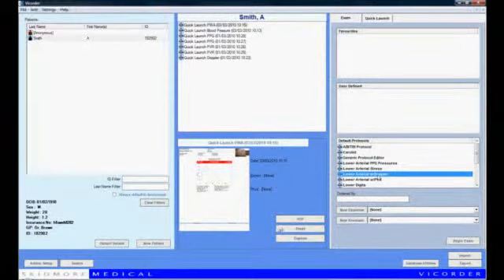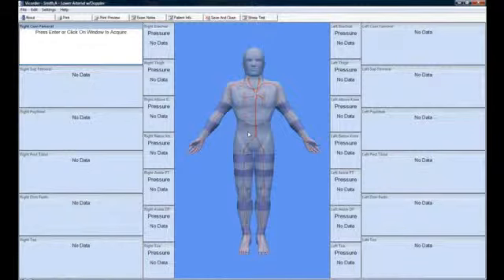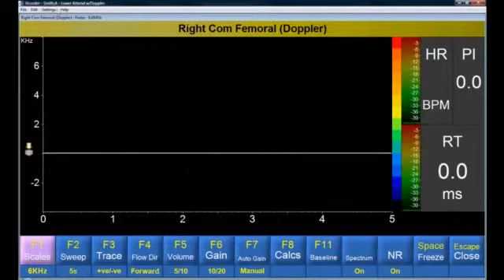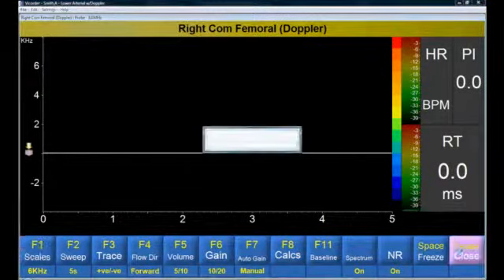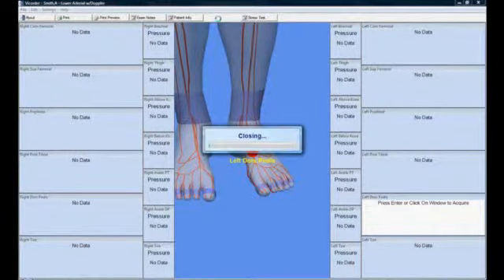Protocols may be launched by double-clicking on the selected item from the protocol list in the right-hand panel. Each protocol can be automated and has editable data acquisition sites that may be launched with a single click. Clicking Save and Close returns to the admin screen.